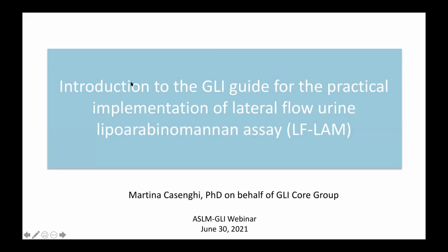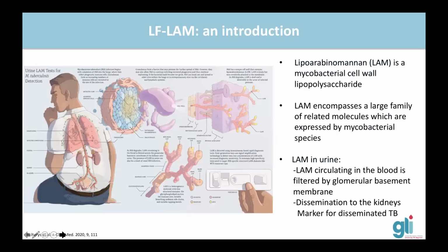Before jumping into the content of the GLI guide, let me give you a quick introduction to the LAM as a biomarker for TB diagnosis. I will repeat some of the concepts that Kathleen just mentioned.